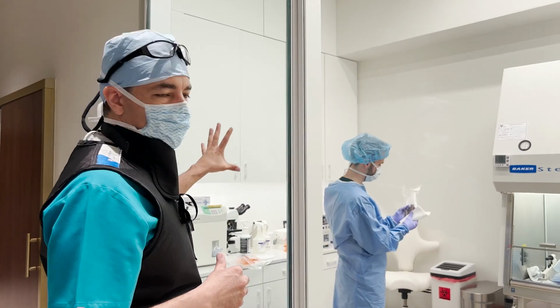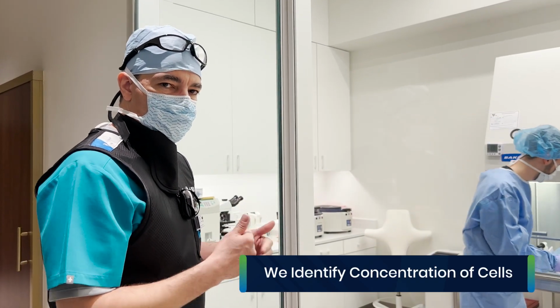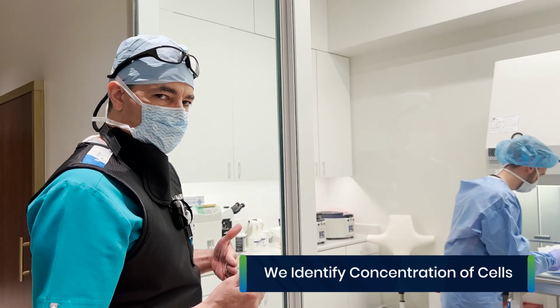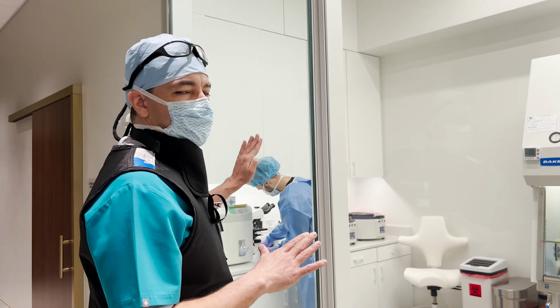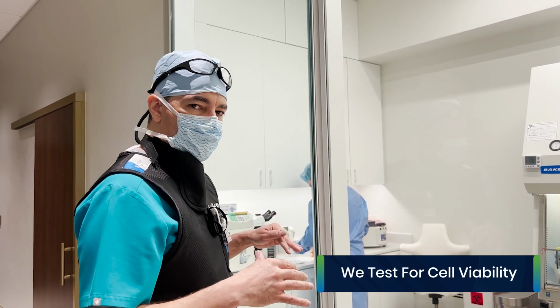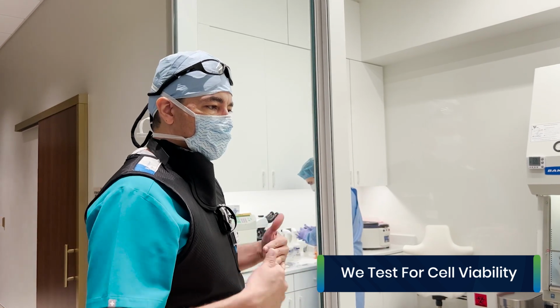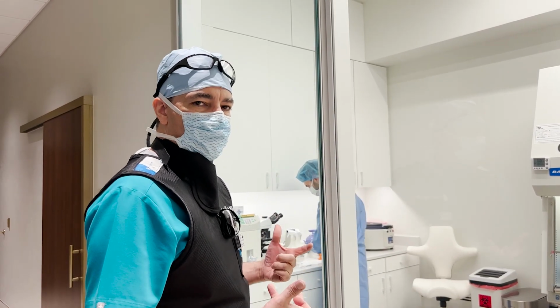In addition, we'll actually measure the cell content. So what is the concentration of cells per cc of fluid that we're pulling? And then as we concentrate that and prep it, at the end, we'll test what we call cell viability. So we know how many of those cells are actually alive, because merely by processing the cells and taking them out of the body, you're gonna lose a small percentage.